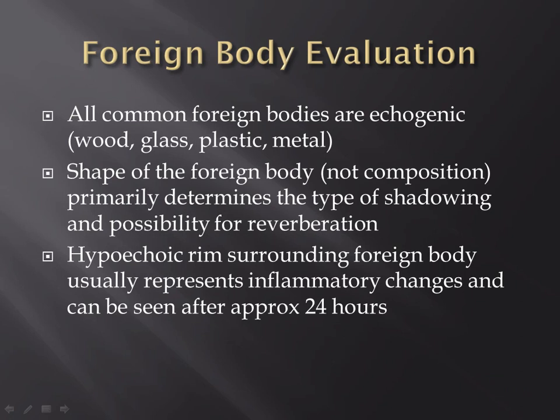Now, foreign body evaluation. We've talked about this a little bit already in a few lectures, and I think this is where ultrasound is really, really good. During fellowship and residency, we had the opportunity to diagnose lots of wood splinters with ultrasound, sea urchin spine, and a pampas grass sliver in the palm. And so we've used it a fair amount with good results.